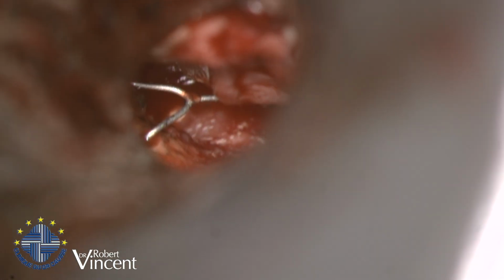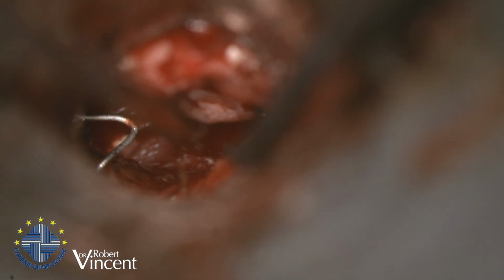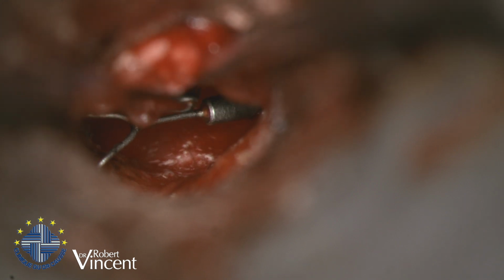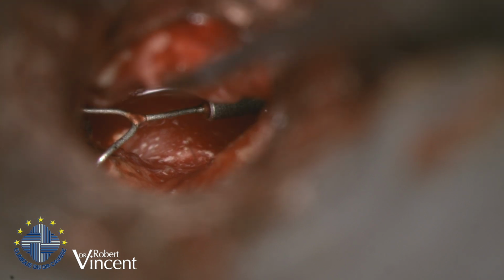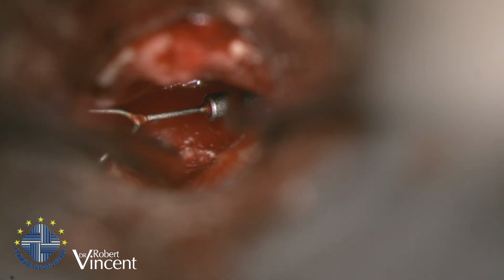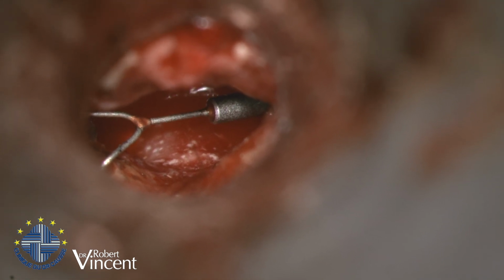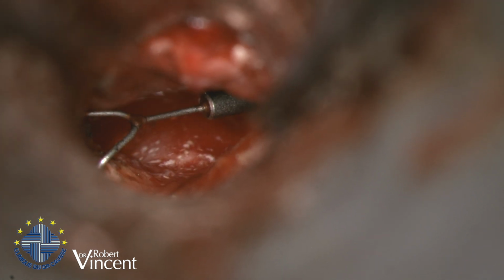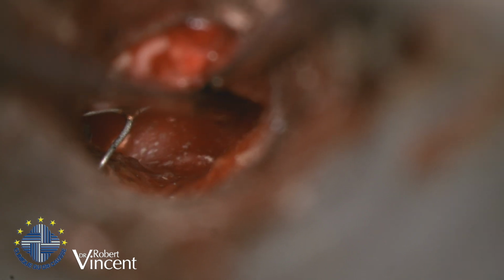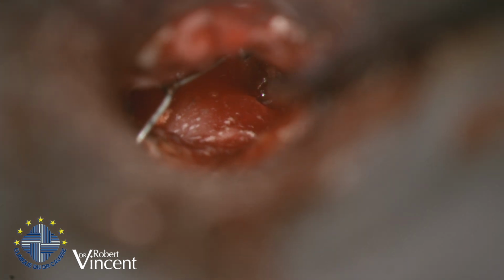All right, I think it's fine. So let's see how it works with the oval window. I think it's long enough. Bravo, s'il vous plaît. Ou plutôt, oui, ça ira. On va prendre un 9 là. Okay, it's long enough. You see, it's over the oval window. We'll see better in a minute, because if I remove the blood, we'll be able to see it. Yeah, the oval window is there. You see the footplate there down. So I will move a little bit anterior, and it will be fine enough.